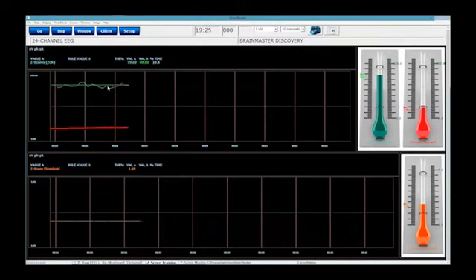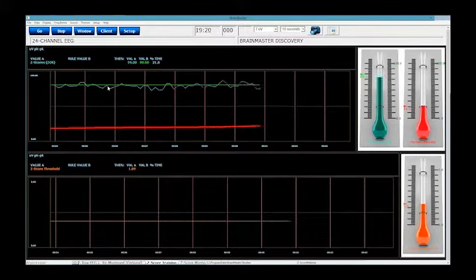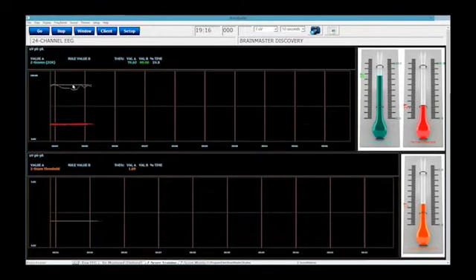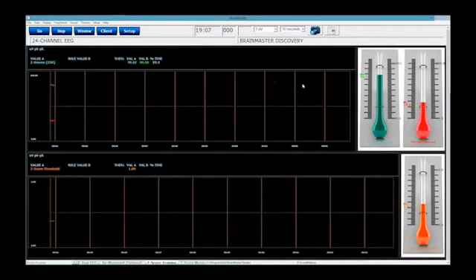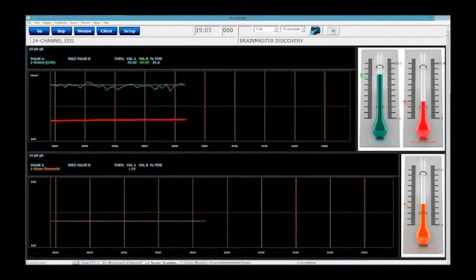And that is how we do our ZScore training. It's PZOK. It's the percent of Z-scores that are okay, if you will. And right now we're saying on this screen, if our Z-scores are above this green line right here, which is our threshold that is controlled by the C key, that's going to control everything. You're going to get a MIDI sound that's going to be rewarded back to you.